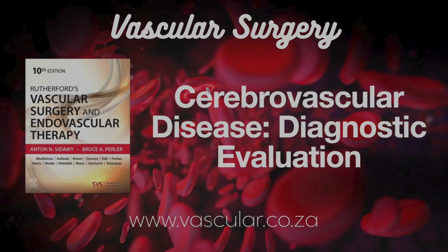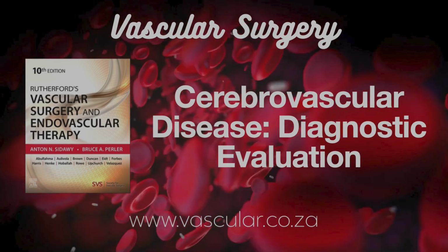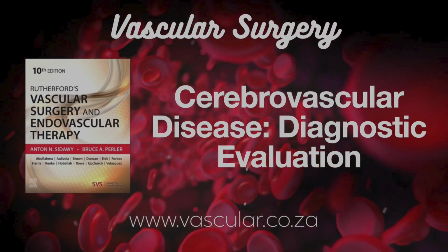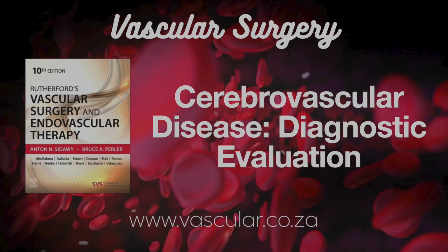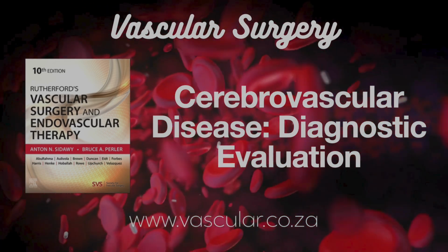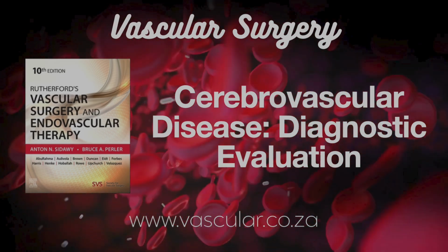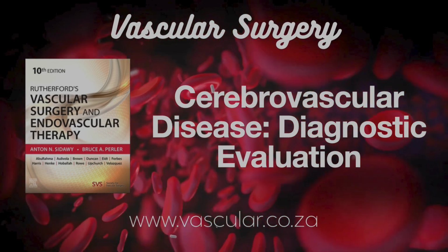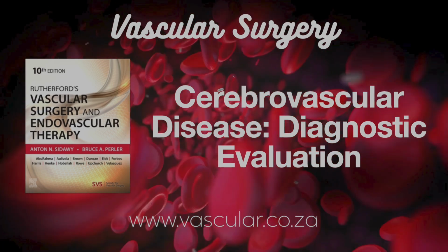Okay, duplex ultrasound, or DU, it's like getting two views at once. You've got the standard ultrasound, the B mode, which gives you that black and white picture of the artery itself, lets you see the structure, any plaque buildup. It's just the physical shape. Right. But then the duplex part adds Doppler ultrasound. Yeah. And that measures blood flow, how fast it's moving, which direction it's going. So it's not just static, it's looking at the dynamics. How does knowing the speed help detect a narrowing?